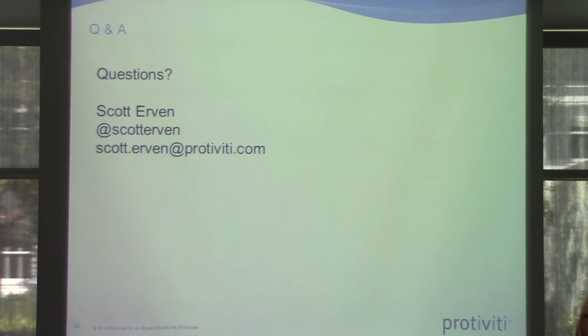The ventilators are critical when it comes to population health management, because what happens is we've got this guy that, oh no, they just died from pneumonia. So they want to figure out what is the root cause of it. Well, how do we do that? We get big data. How do we get big data? We plug that serial device through an Ethernet adapter, use a proprietary protocol, dump it into the medical record. Now it's on the network and you can interface with it.